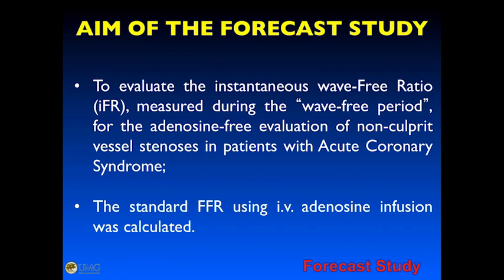The aim of the FORECAST study was to evaluate the instantaneous iFR, measured during the wave-free period, for the adenosine-free evaluation of non-culprit vessel stenosis in patients with acute coronary syndrome. The standard FFR using IV adenosine infusion was also calculated.